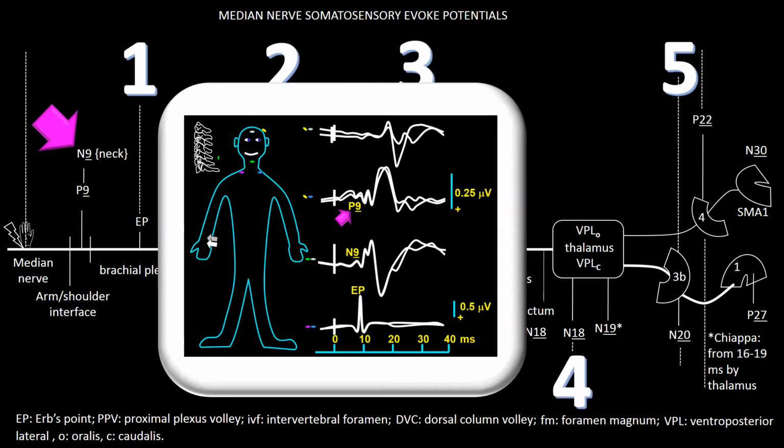At the level of the scalp, this potential presents as a positive potential when recorded from the contralateral scalp to the contralateral ear points. At the level of the neck, its interpretation is more confusing. It is recorded as a negative wave as indicated by the arrow when recorded using a derivation going from the neck to the forehead. This derivation is depicted in this frame by the green and the light gray ovals. Kimura, in his book, mentions the possibility that the Erb's point potential contributes to the negativity of this potential.